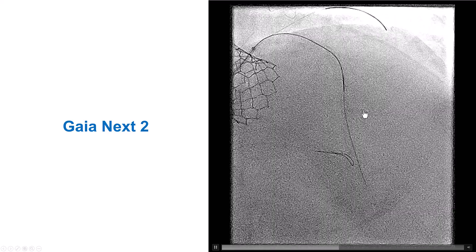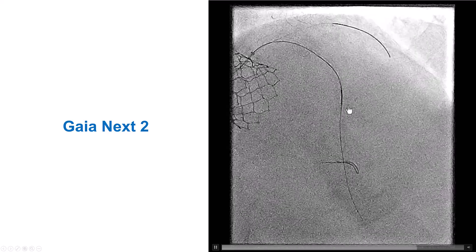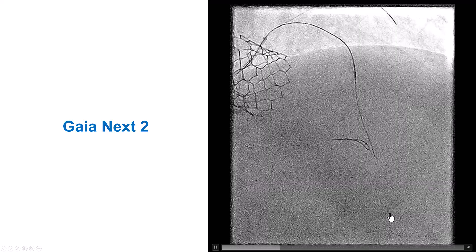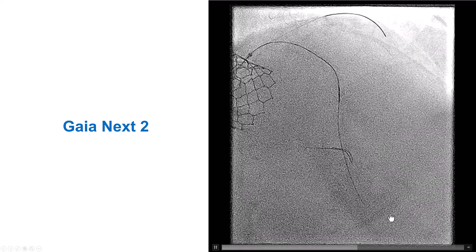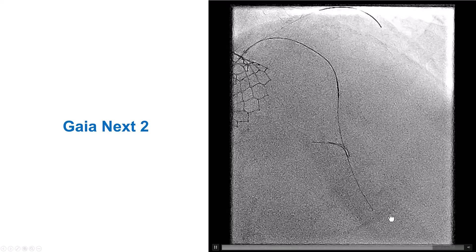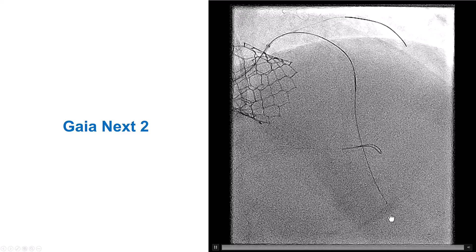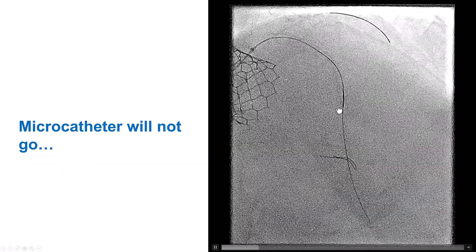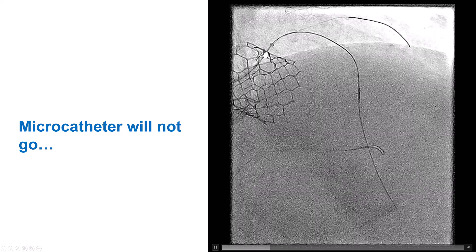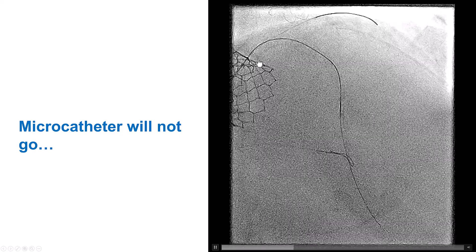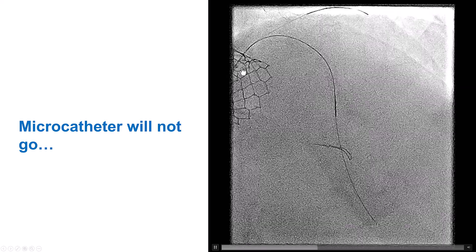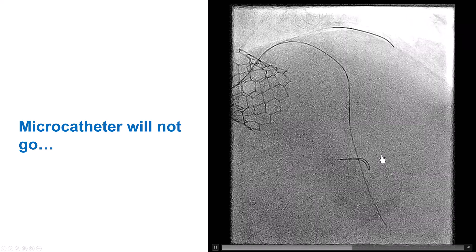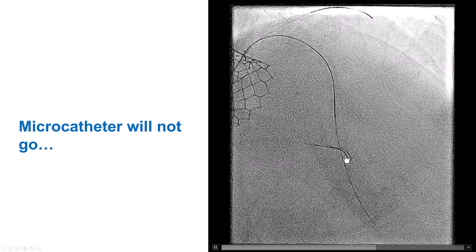We then changed to a Gaia Next 2 wire, and the wire actually easily crossed into the distal LAD, which we thought was excellent and close to the end of the case — but we were wrong, because we were unable to advance a microcatheter, due to poor guide catheter support. The Trapliner did not give us enough support to advance the Turnpike LP to the distal LAD.